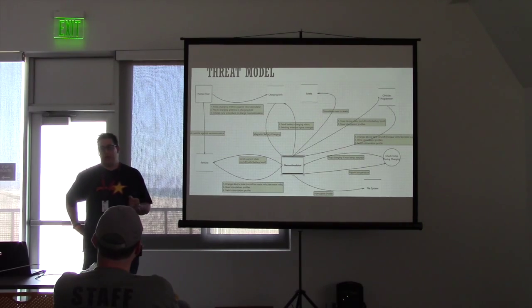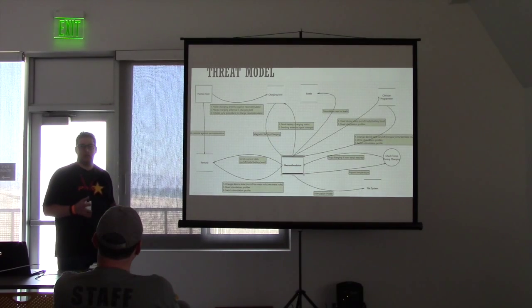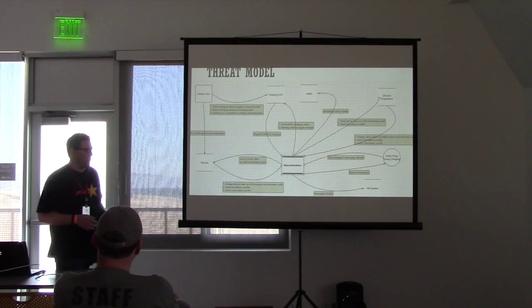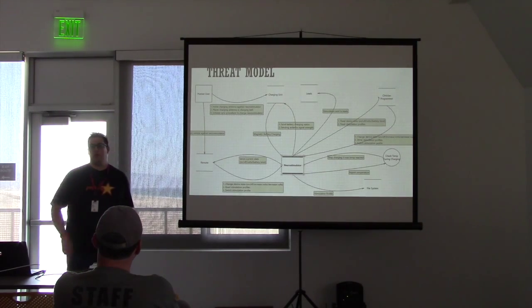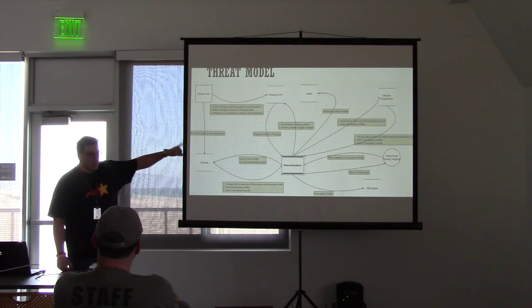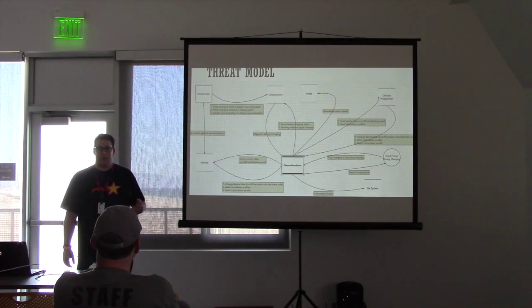She has to get under that to do it. That was built as a security feature to basically kill part of the threat. So it's not like someone sitting there with an antenna from across the room trying to enable or disable this device. Then there's magnetic battery charging, which is lovely because you're heating up the skin with a magnet.